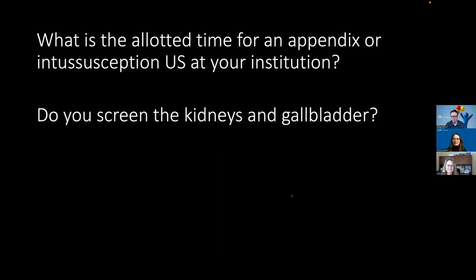All right, so some questions to my co-moderators. What is the allotted time for an exam at your institution, and whether or not you screen for the kidneys and the gallbladder?